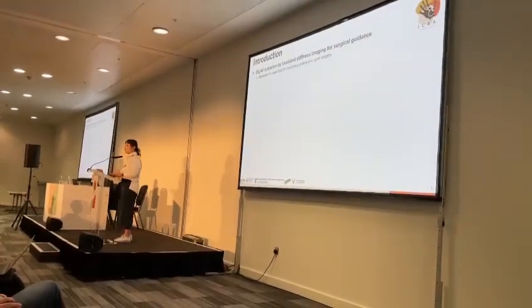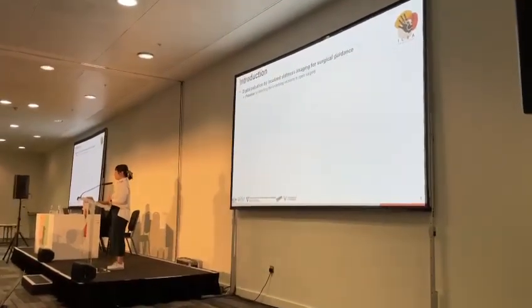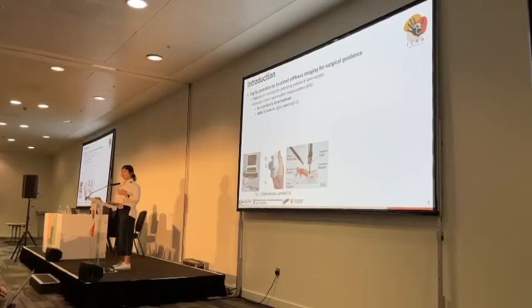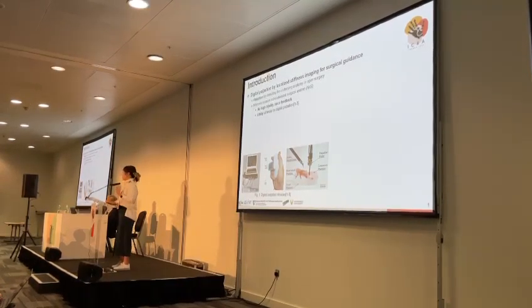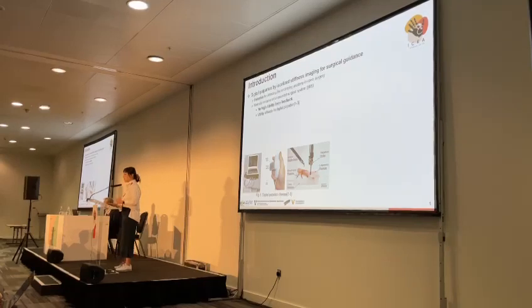The palpation of underlying anatomy during open surgery is used to detect nerve bundles, arteries, and tumors. Minimally invasive surgical systems do not offer high-fidelity force feedback sufficient for conveying stiffness information to the surgeon. Researchers in the past two decades have spent significant effort exploring the utility of tools for digital palpation.